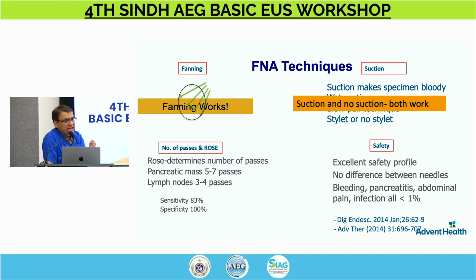If it's a FNA needle, you can do 3-4 times in one place, then change the direction. Total FNA passes could be 12 to 16, but if it's FNB needle, many times you get this tactile sensation, like when the tissue is coming into the needle. If you feel that, when you develop that sensation, you go in one area, no need to go back into the same area, bring the needle back and change the direction. Usually you don't need to do more than 4 or 5 times.